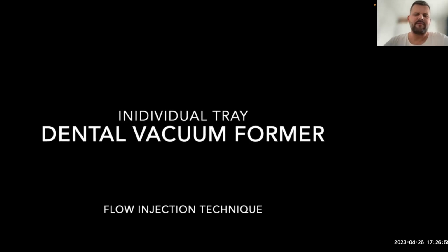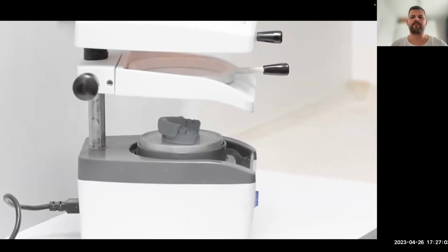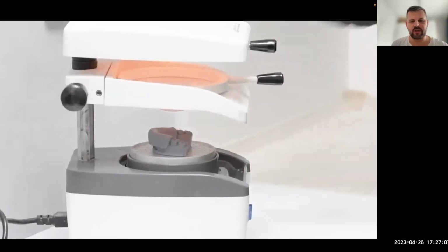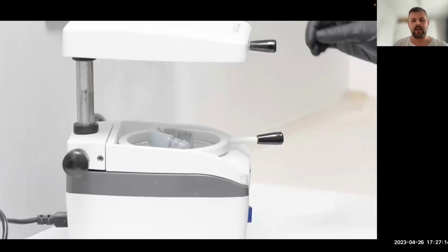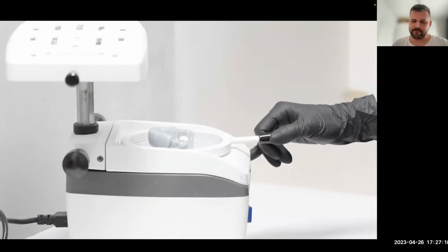This is the same as when you are making night guards or maybe trays for bleaching. It's almost the same. You can, of course, use your digital model to prepare something like that.